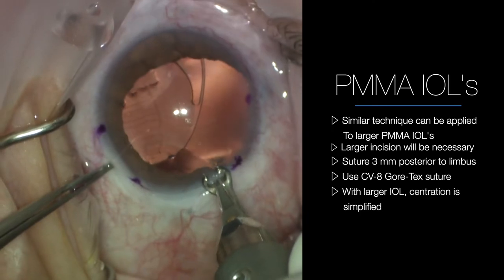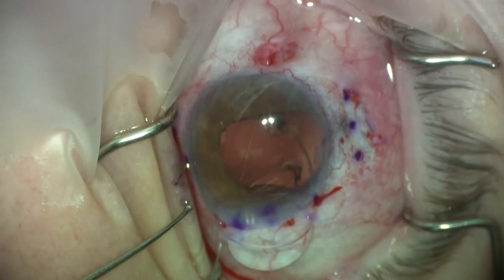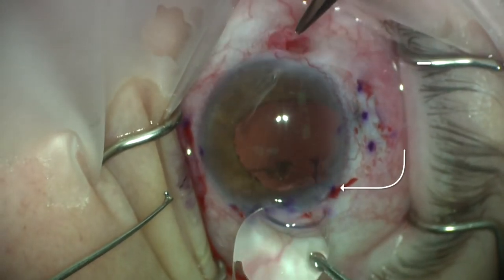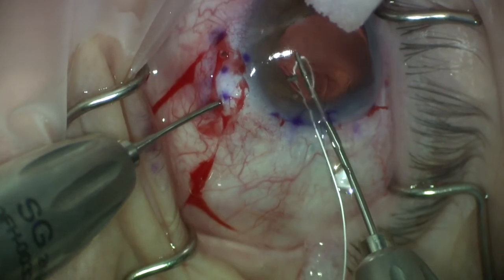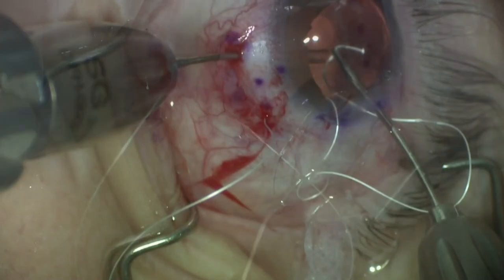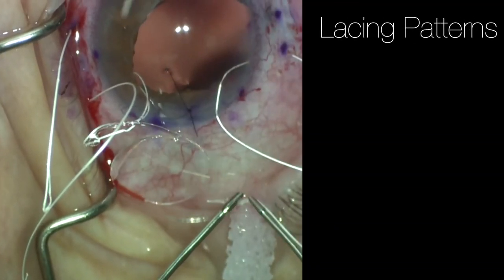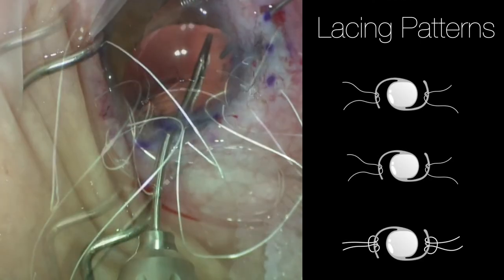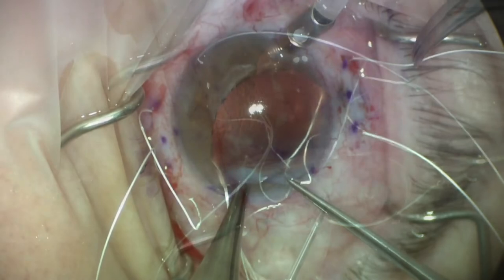You can also apply this technique to larger implants — you don't have to use small foldable IOLs. A single-piece PMMA IOL like the CZ70BD can also be used. In this case, the suture had broken and the implant was mispowered, so we exchanged the lens. The idea is the same: 3 millimeters back, 4 millimeters apart, 180 degrees across the eye. There are multiple ways to lace the haptics — I use a torque/anti-torque pattern — but there's more than one way to skin a cat.